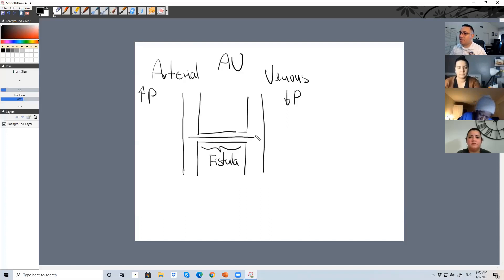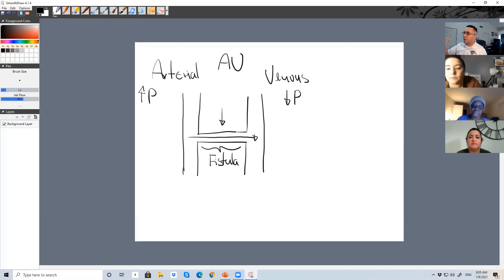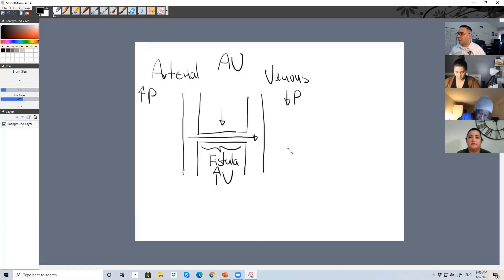Because the flow goes so fast through the fistula, when you do your Doppler on this area with color flow, you're going to see aliasing, giving a mosaic appearance. If you place your sample volume there, you'll also see aliasing, and the peak systolic velocity will show below the baseline because of the high velocity. This is due to the pressure difference between the arterial and venous sides. If the velocity and volume flow rate decrease over time, that tells you there is a problem.